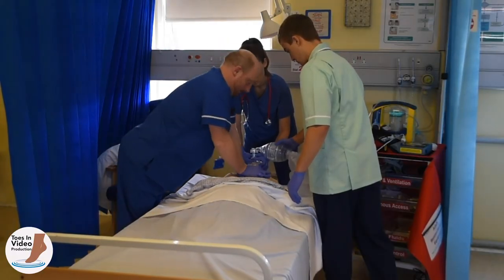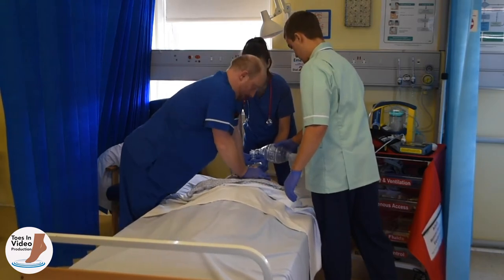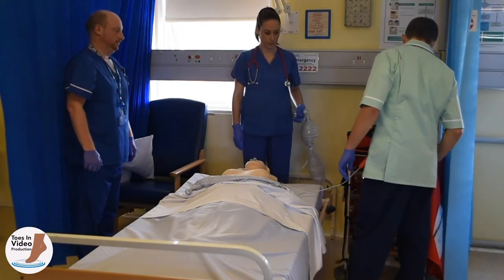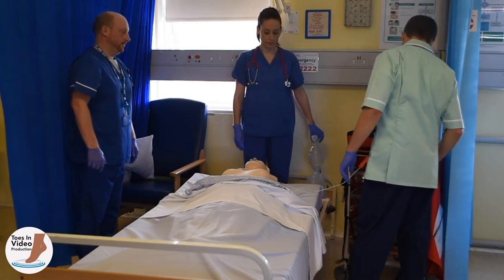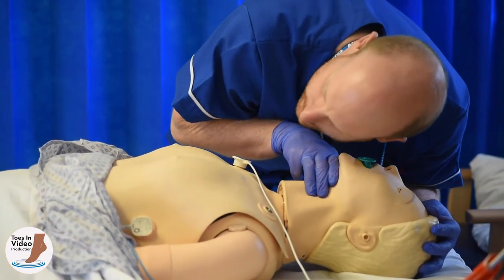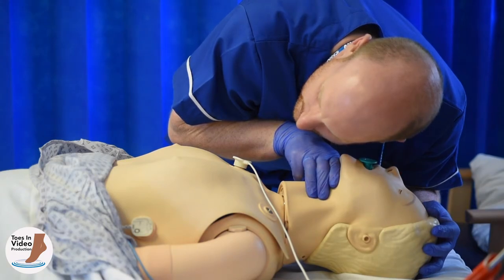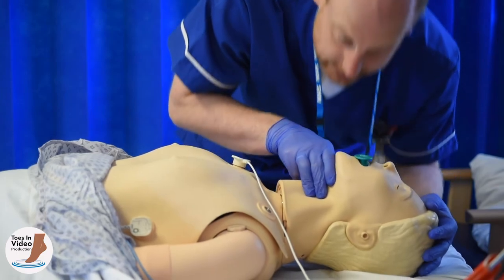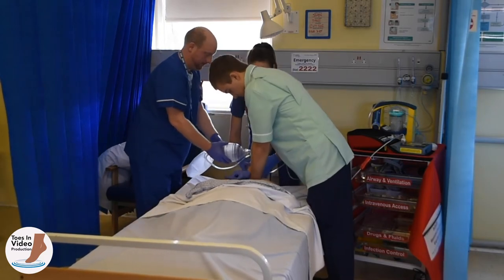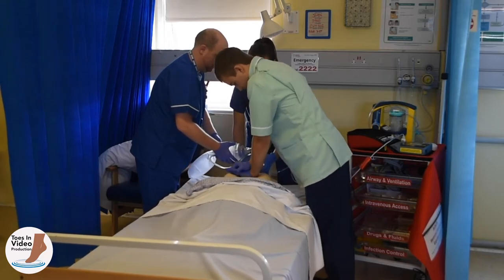At the end of a two-minute cycle the automated external defibrillator will ask you to stop to perform further rhythm analysis. If the defibrillator indicates that no shock is advised, rapidly assess the patient for signs of life — only if competent to do so should a pulse be palpated at any stage of a cardiac arrest event. If there are no signs of life, the patient is in a non-shockable rhythm; recommence CPR as soon as possible and continue at a ratio of 30 compressions to two rescue breaths for a further two minutes.